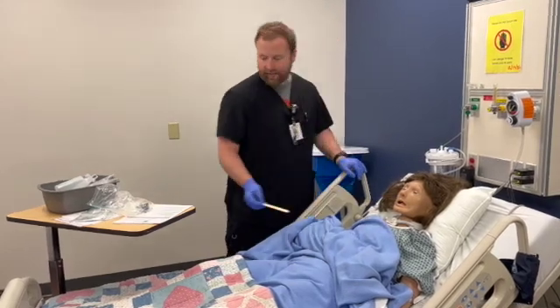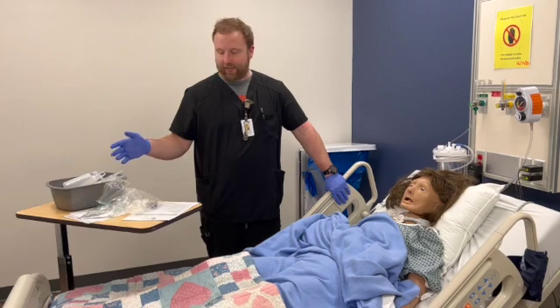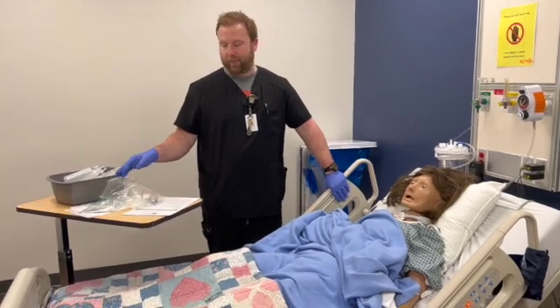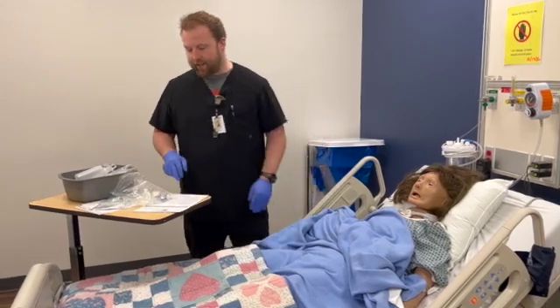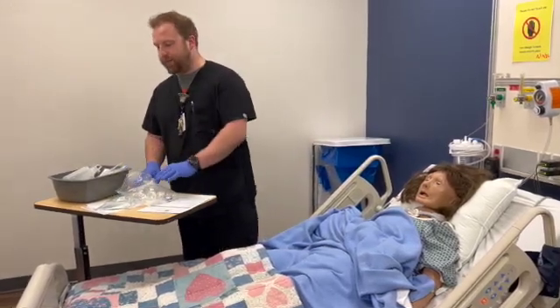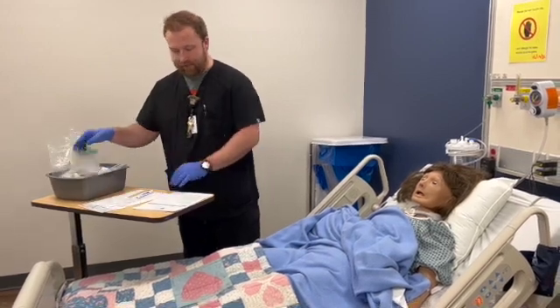making sure he has a gag reflex, and the mental status of the patient, if he's alert and oriented, and if he can help with the procedure. And lastly, we will assess for the size of the tube needed for the NG insertion, which you can find on your orders, which is a 12 French.